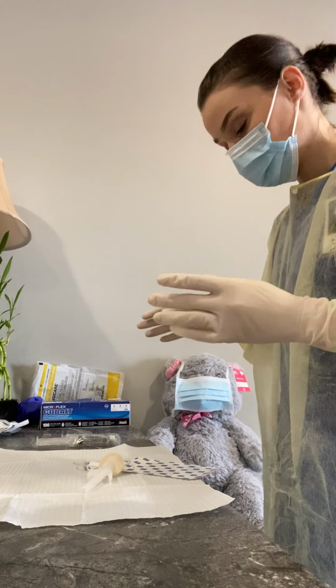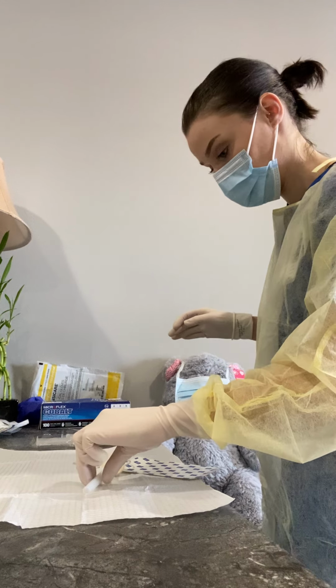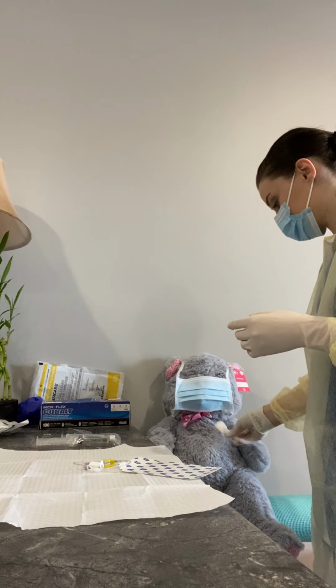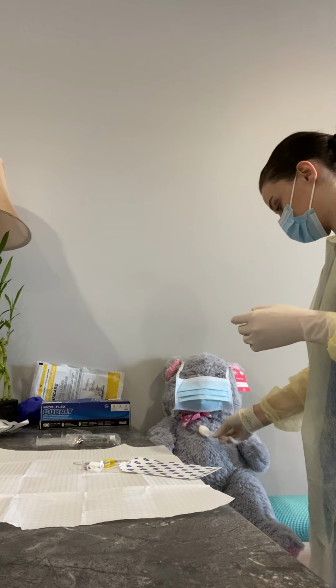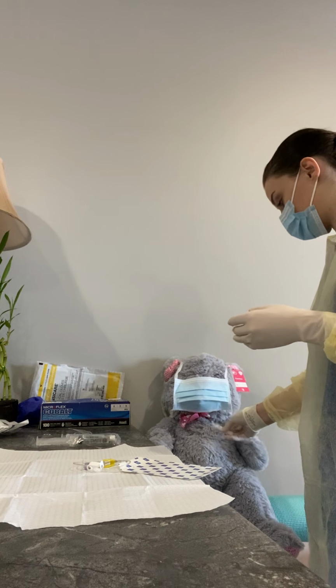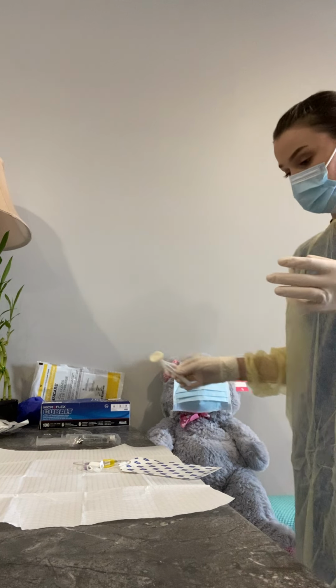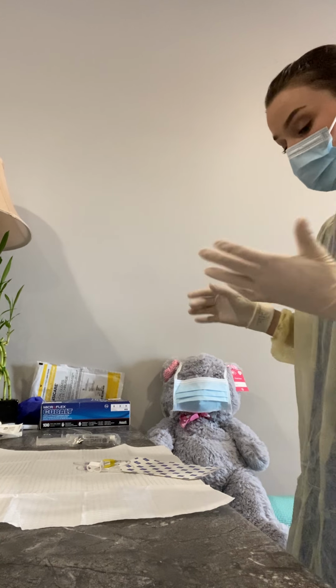Okay, so I've got my ChloraPrep, and I'm going to clean the site from in to out, as big as where the Tegaderm is going to go as well. And I'm going to discard of that.